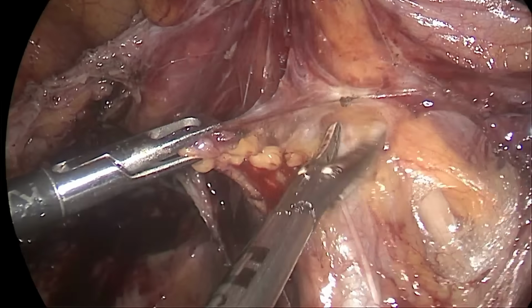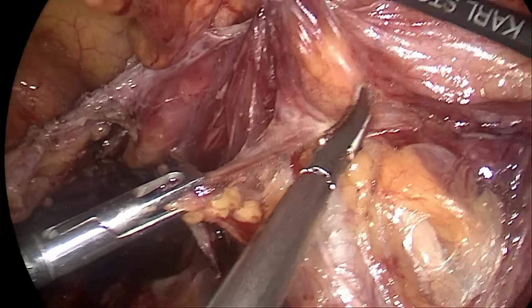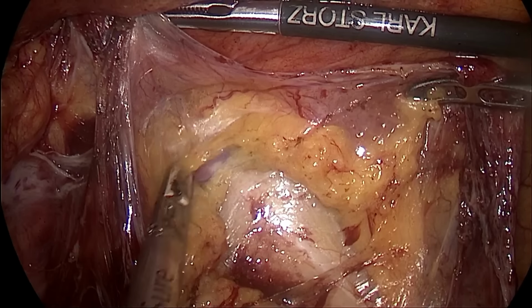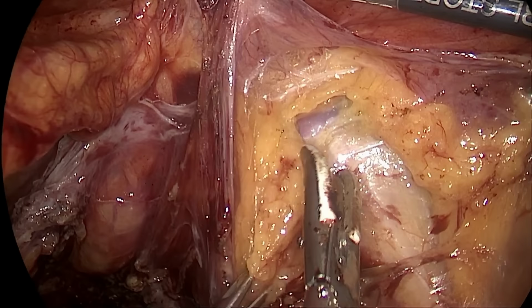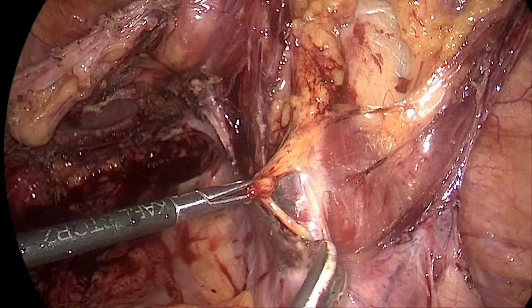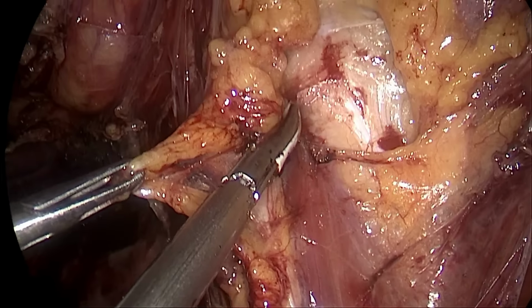So I'm trying to skeletonize the external iliac artery here. That's our deep circumflex iliac vein. That's the limit of pelvic lymph node dissection.